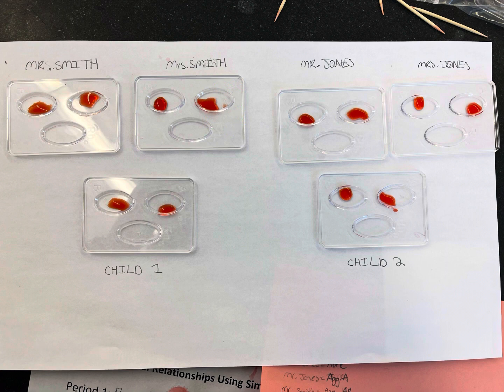As for child 2, no agglutination occurred, meaning he had type O. This matched Mrs. Jones' blood type, meaning child 2 belonged to the Jones family.